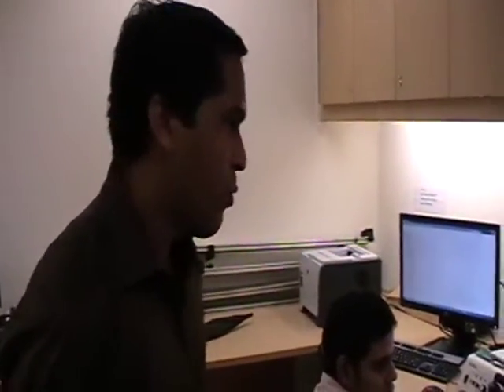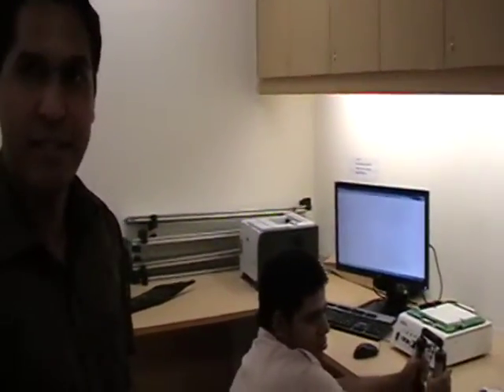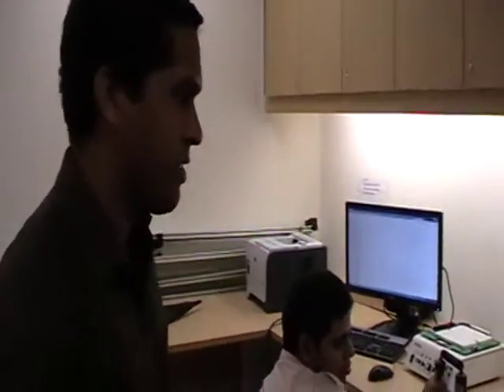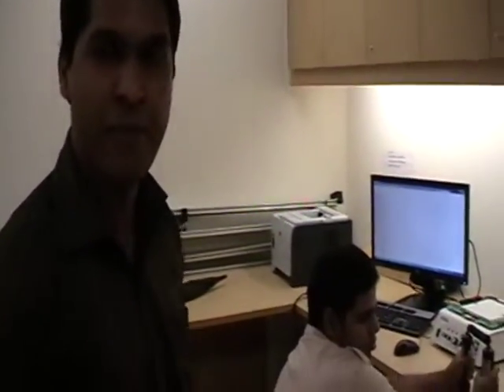Okay, the additional feature that we implemented to this system is the heart rate information data logging. So what happens is that these heart rate signals acquired from the patient's heart are stored in the form of electrical voltages. There should be a corresponding electrical voltage, as I explained earlier. So this data log file will be created in real time. That means every second it will be creating corresponding electrical voltages.